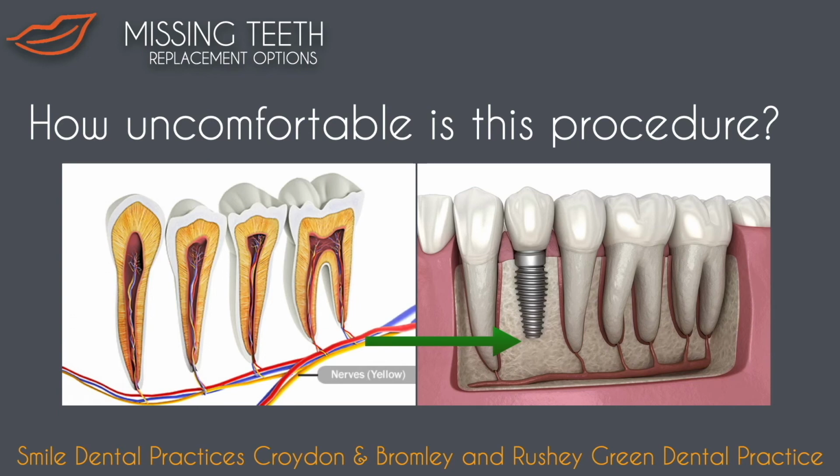We need to manipulate the gum in order to place the implant. Sometimes this area can get sore. However, this can be likened to when you cut your skin. When you cut your skin, for a period afterwards, every time you touch that cut, you are aware that something has happened, but you very rarely need to take painkillers.